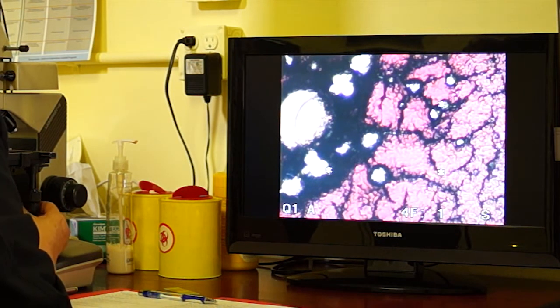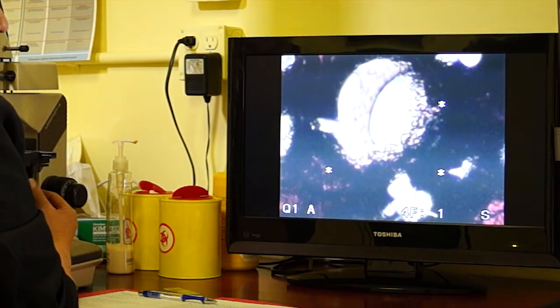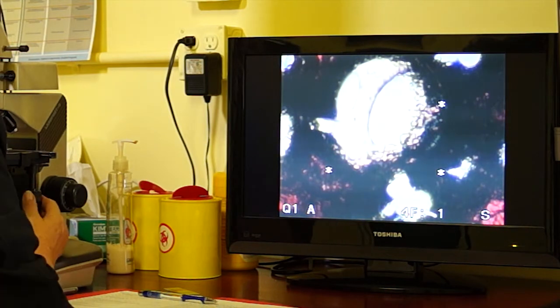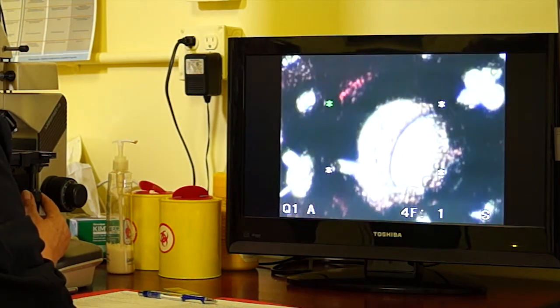That type of thing. Inside here, I'm just going to increase this a little bit more so that we can see, but these little black circles on the edges here are an indication that your bile ducts off your pancreas and your liver are plugged. This can give you some discomfort under your right rib cage towards the back.